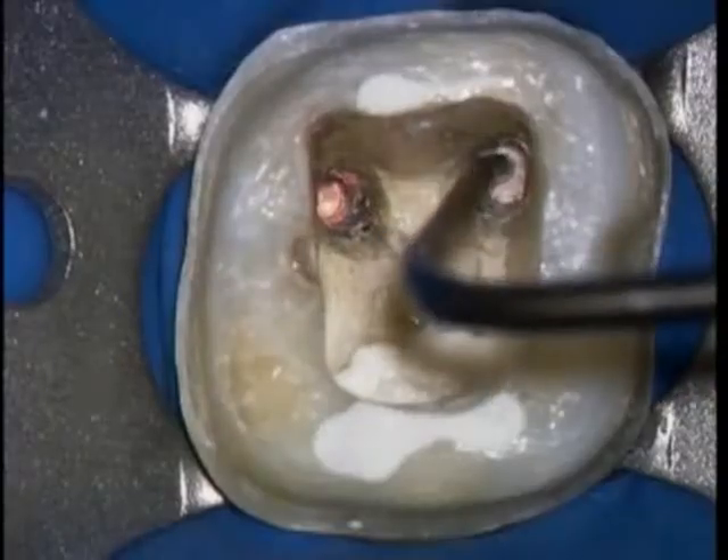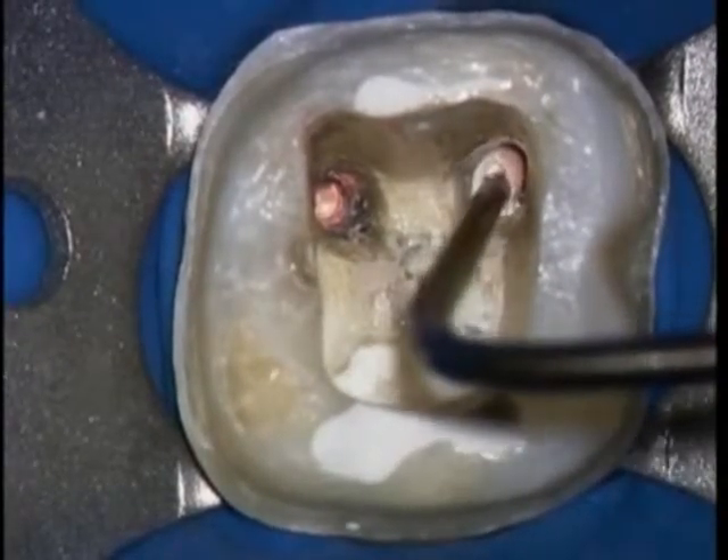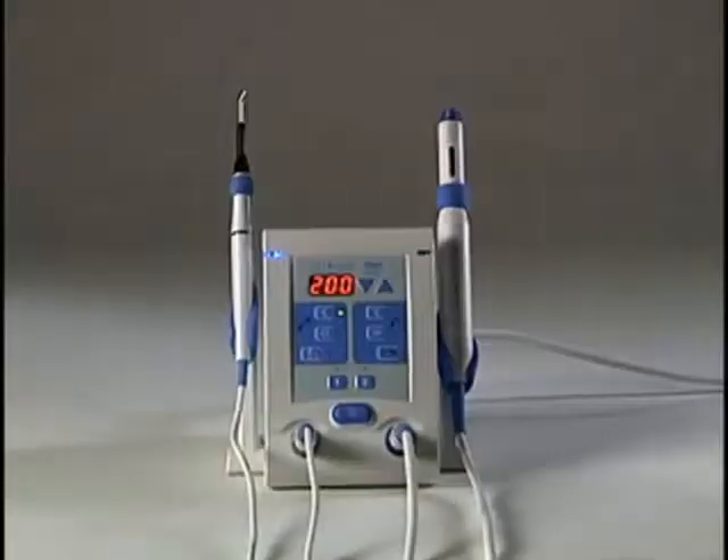Do not stay in the root canal space with a heated tip for more than 4 seconds to prevent thermal injuries.